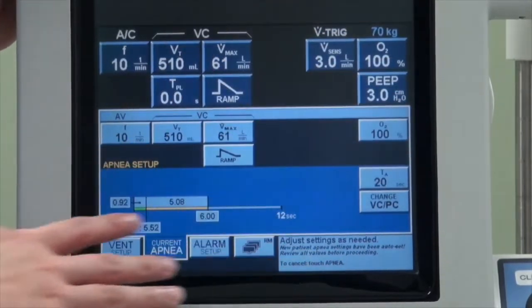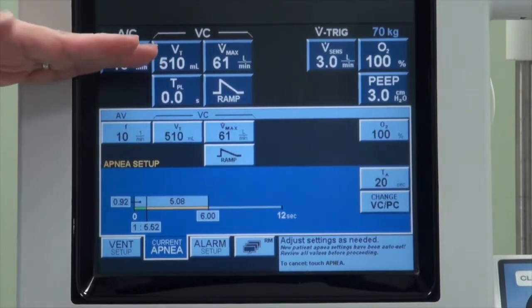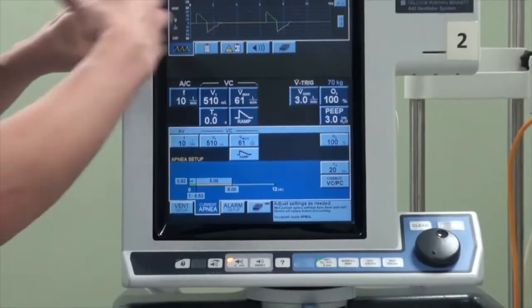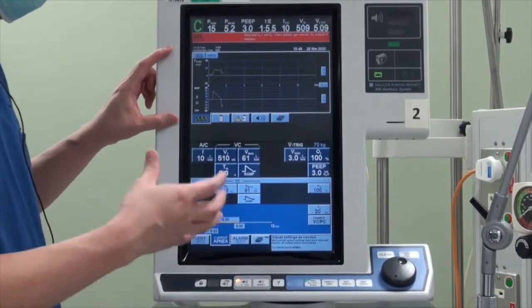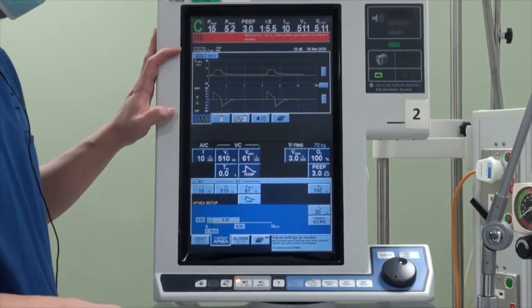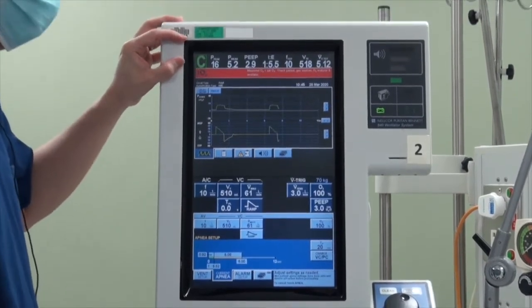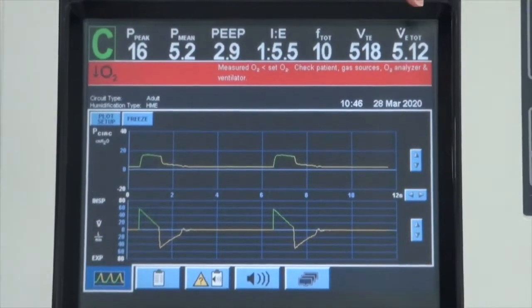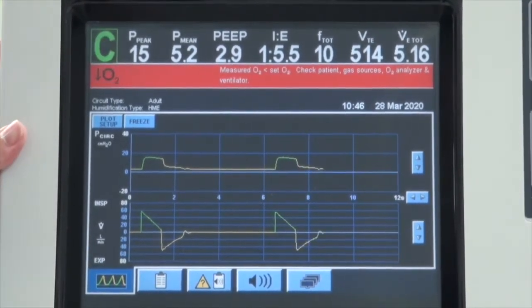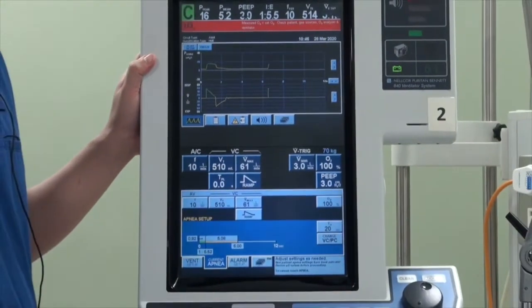So now we are at the main screen that you will be interacting with. You will notice this is a touch-based screen with buttons at the bottom. The bottom half of the buttons are the mechanical settings that you input. The central segments are the waveforms that help you determine how well the patient is synchronizing with the ventilator. The top half shows the parameters measured from the patient. We will go from left to right to explain what these buttons mean.